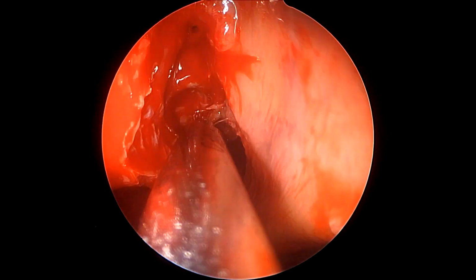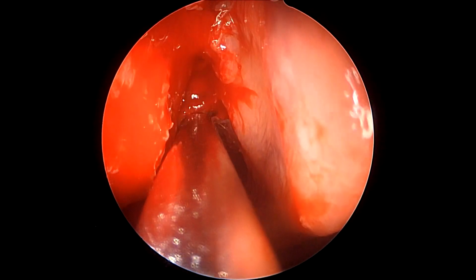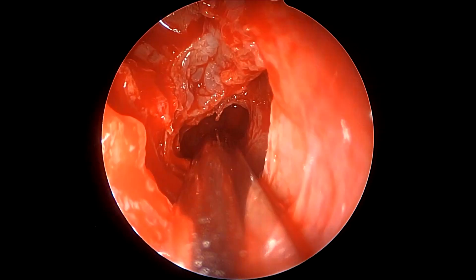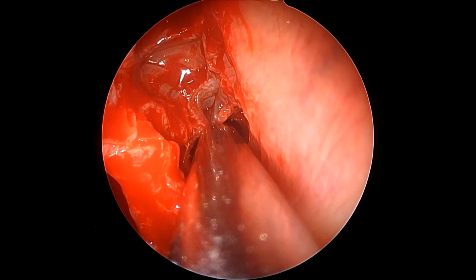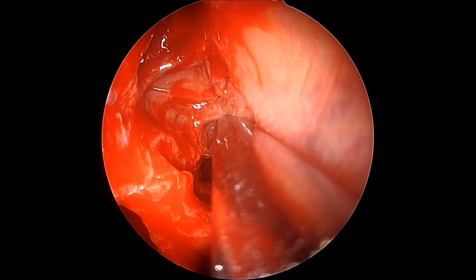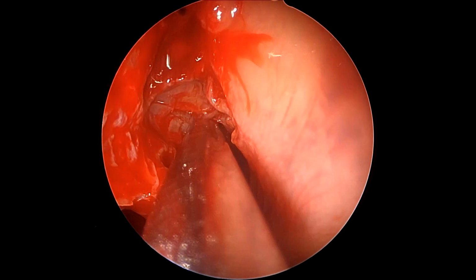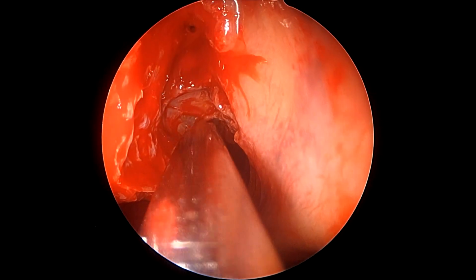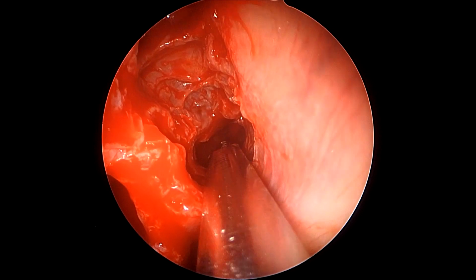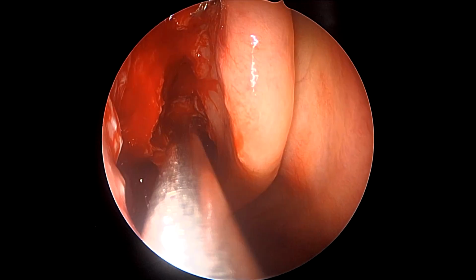Once again, we clear some redundant mucosa over the anterior face of the sphenoid, and as we now know the lowest level of the skull base in the sphenoid sinus, we can safely and predictably proceed towards removing the rest of the posterior ethmoidal septations, which are a very important part of any sinus surgery. This is the posterior to anterior method of doing the sinus surgery.